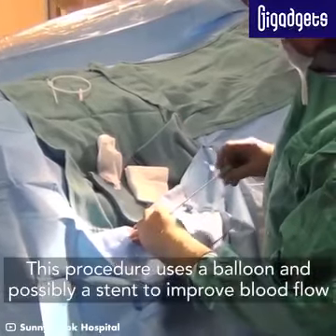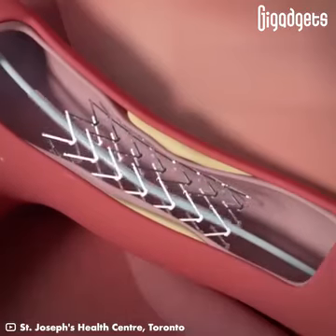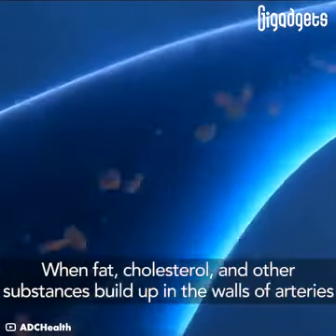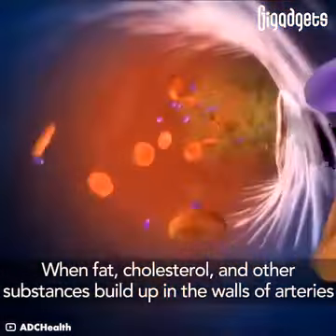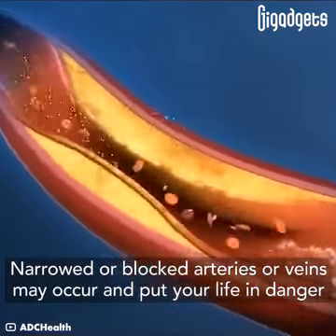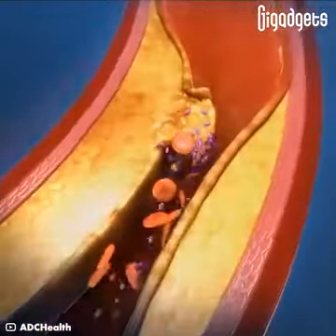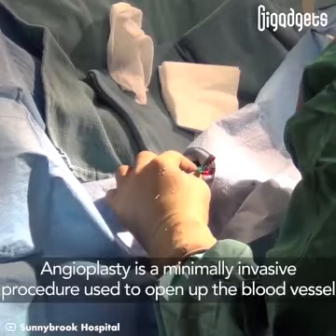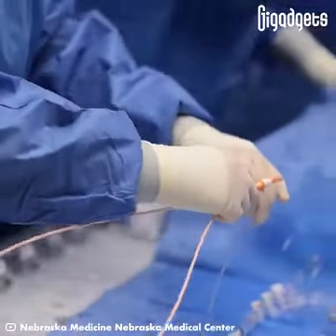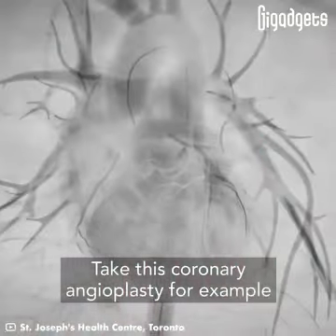This procedure uses a balloon and possibly a stent to improve blood flow. When fat, cholesterol, and other substances build up in the walls of arteries, narrowed or blocked arteries or veins may occur and put your life in danger. Angioplasty is a minimally invasive procedure used to open up the blood vessel. Take this coronary angioplasty for example.